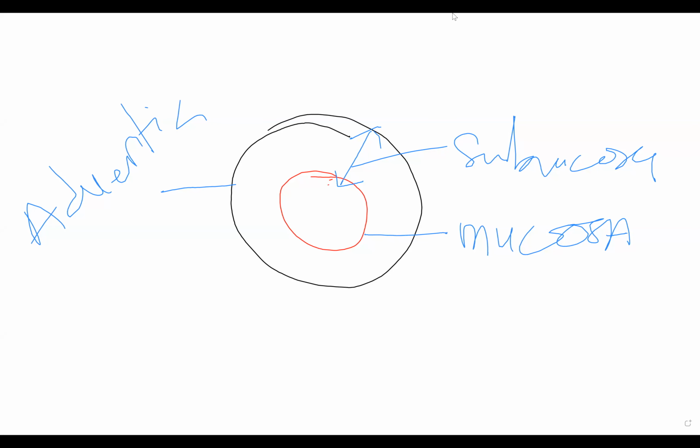For the respiratory histology, what we have to note is what is happening to the mucosa as you drop from the trachea to the alveoli. Then what is happening to the submucosa? In the trachea, there is cartilage and fibers. What is happening to them? You would have to know the differential drop downs from the top to the bottom, from the trachea level. For instance, this is the respiratory system. You have the bifurcation, and then this also bifurcates further, and this also bifurcates further.